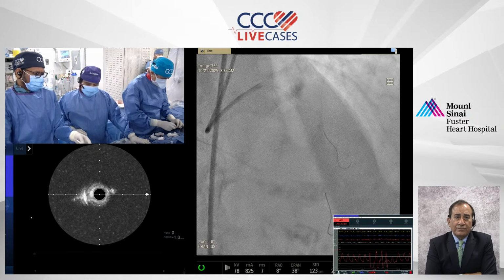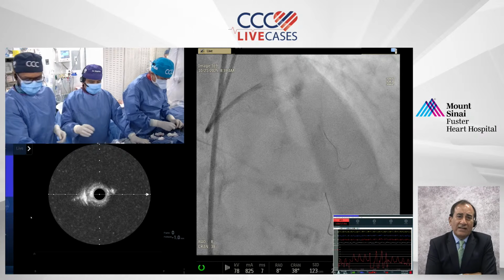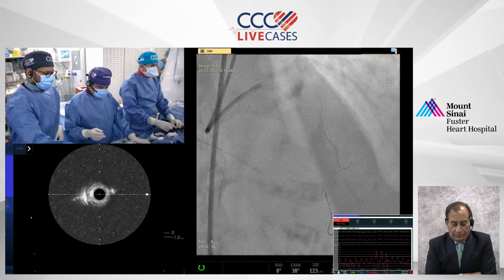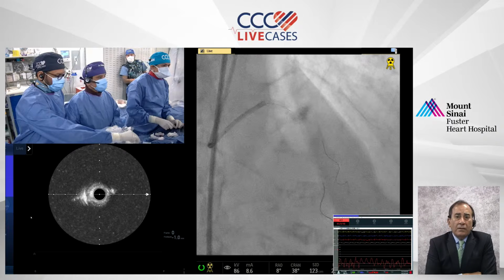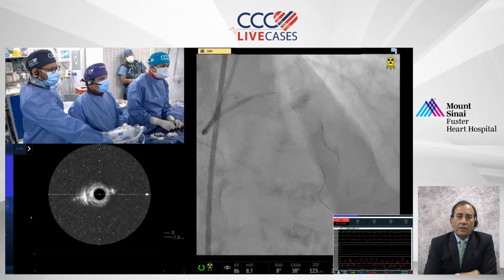No, yeah, that's one. And the 360 degrees also, that is okay for both. Both. No, I would say it is our comfort level. Comfort level, and I can tell you, for someone who is just beginning and wants to use IVL here, this IVL was an okay choice.